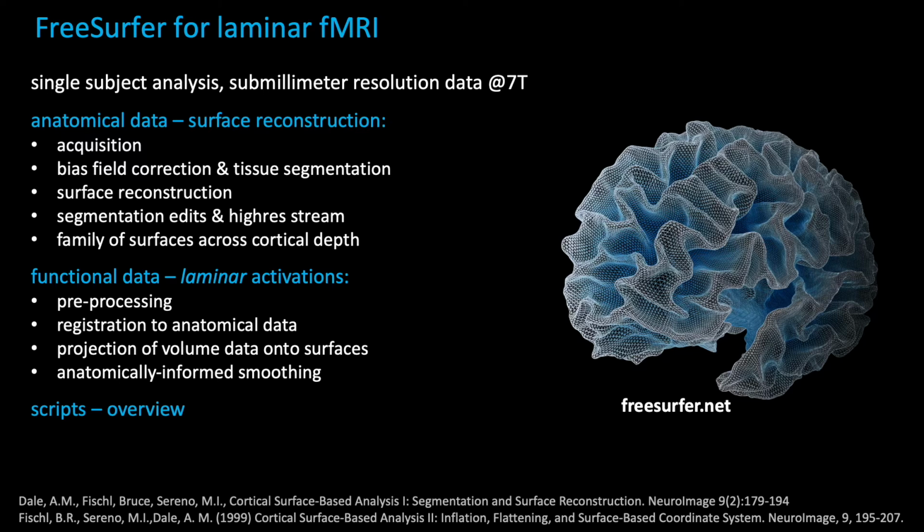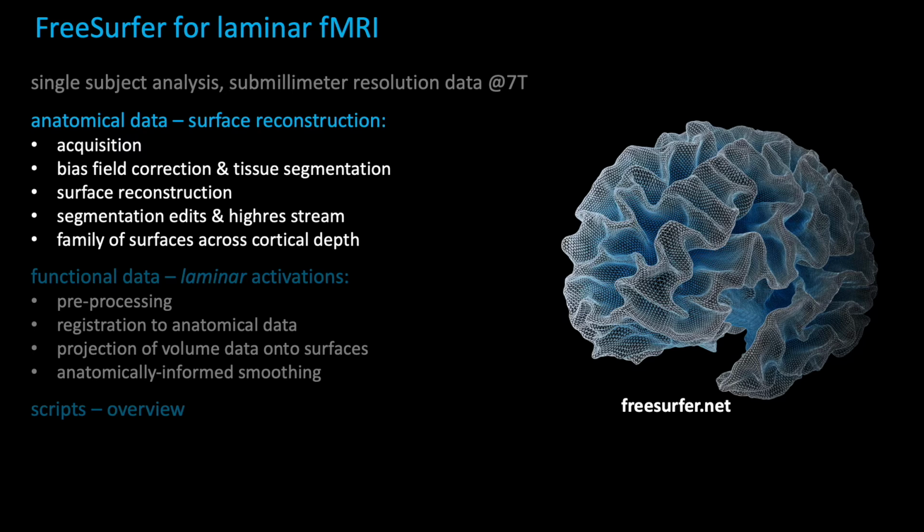Now at the bottom of the slide, we have just two of many references to the original work by Bruce Fischl and Anders Dale that basically put the foundation for FreeSurfer. So there's a lot of literature on pretty much any tool, any method that is part of FreeSurfer. These two are the most relevant for the surface reconstruction. So with that, let's start with the anatomical data.